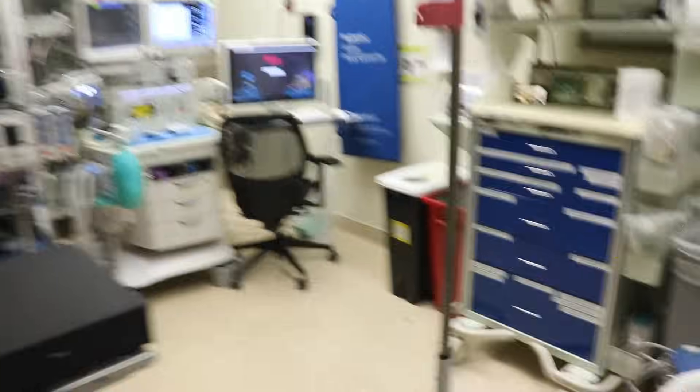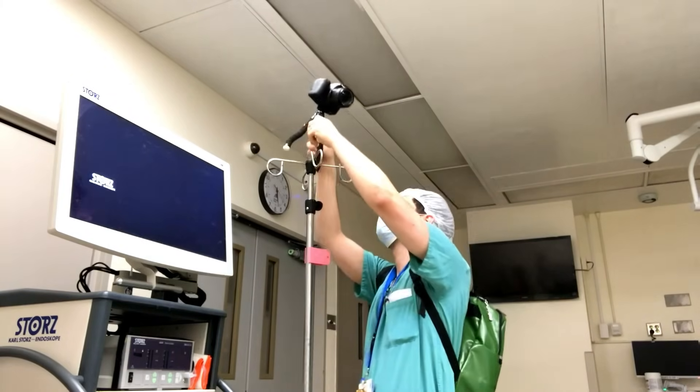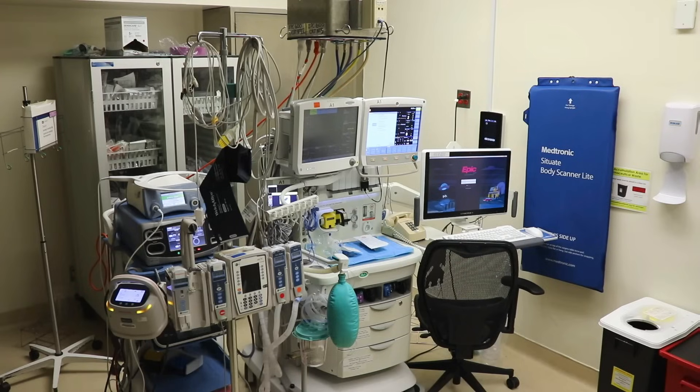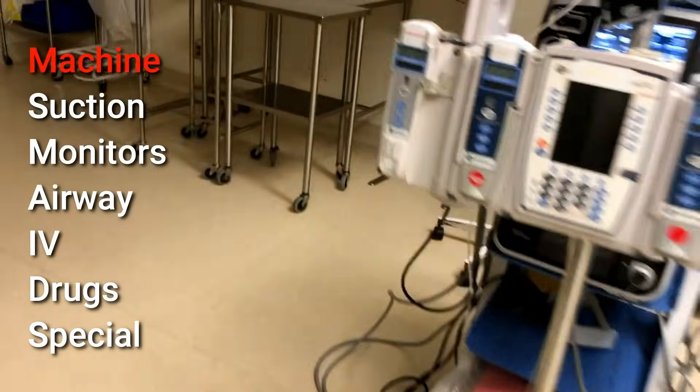I've got this handy IV pole so I'll go ahead and get my camera set up so you can see everything I'm doing. The first part of getting ready for my case is the M in the MS Maids mnemonic, which stands for machine.